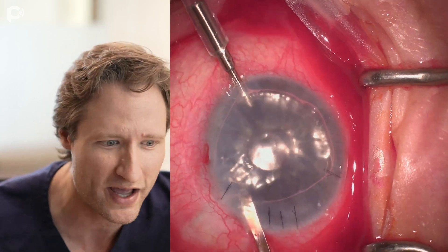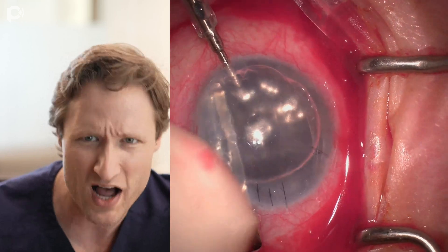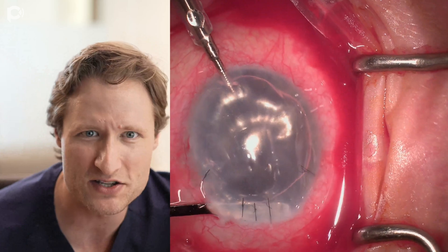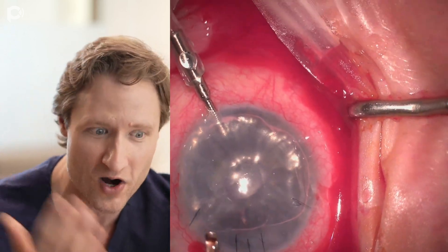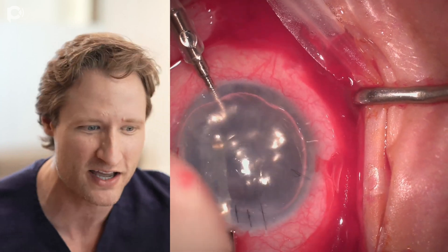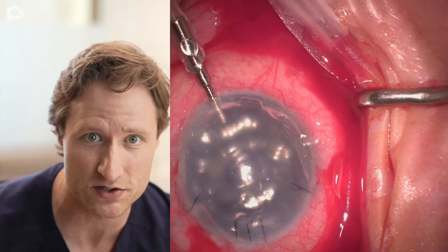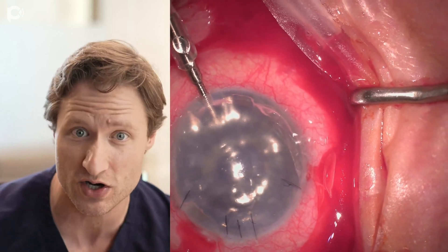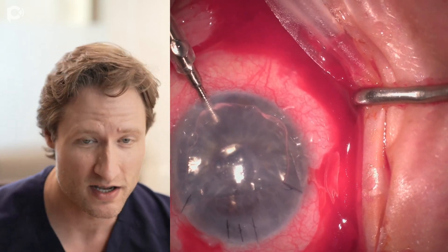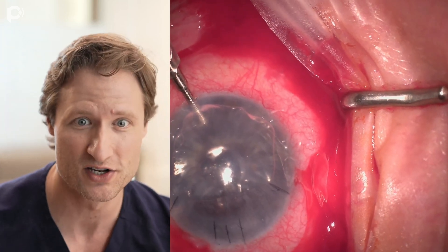The bubble doesn't stretch all the way out to the limbus. The bubble doesn't fill the entire anterior chamber. Even with an anterior chamber maintainer going, the bubble resists filling the anterior chamber. And the reason for that is the key to this whole operation — this is what makes the surgery difficult in a tube shunt eye. The problem with a tube shunt is that tube shunts destroy the zonules of an eye.